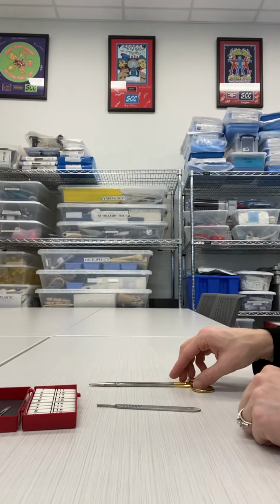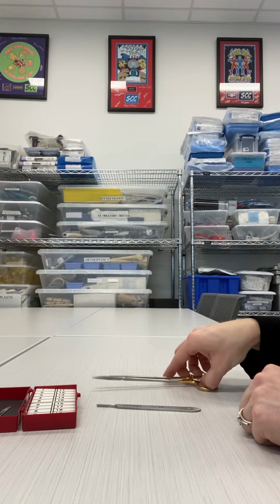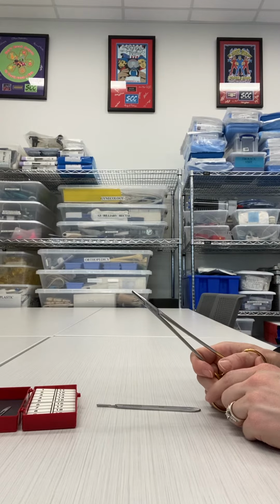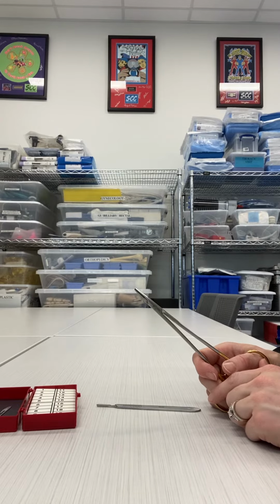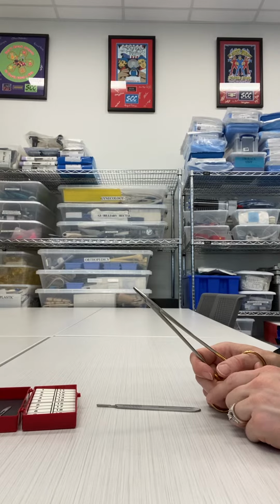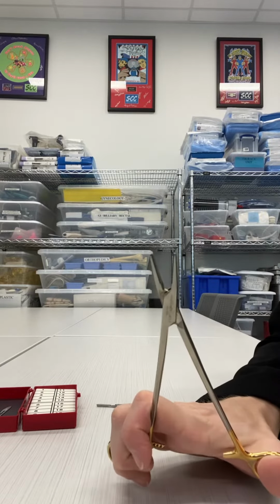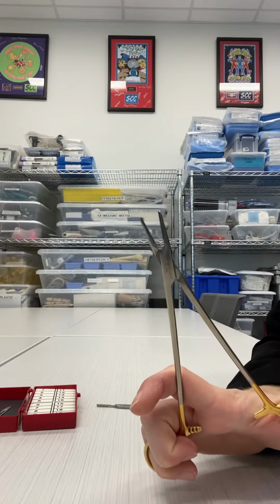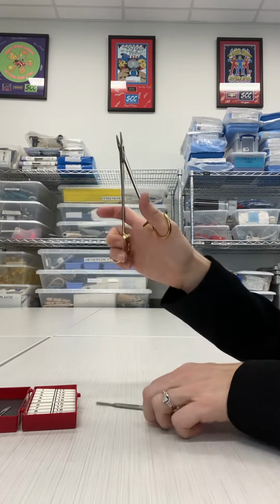This video is going to show how to load a scalpel blade properly with appropriate safety precautions. When we load and unload a scalpel, we never use our fingers because potentially we could cut ourselves. Most of the time we use a needle holder because it's going to have the inserts on the inside that prevent the needle holder from slipping as we are loading this blade.